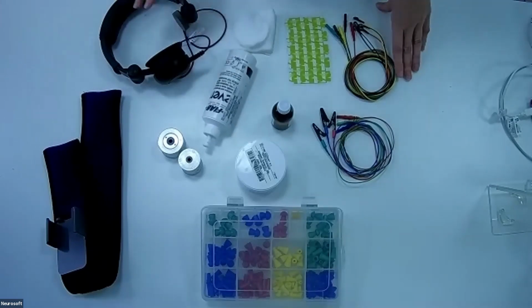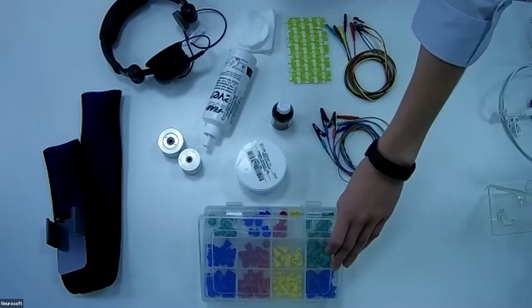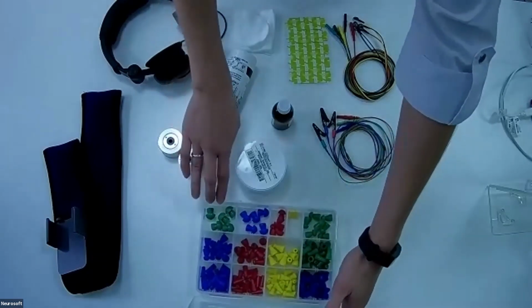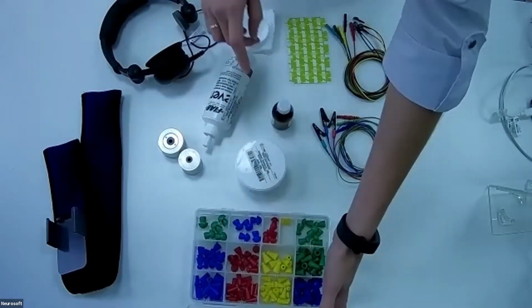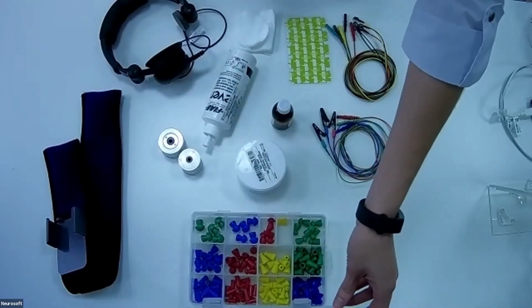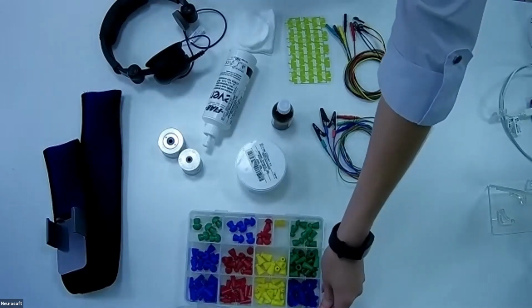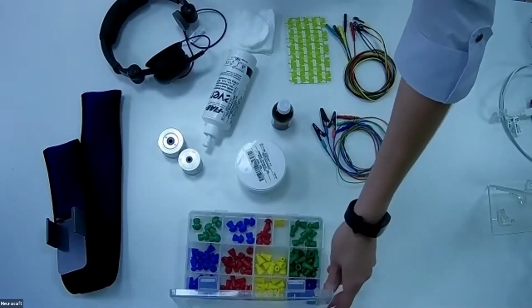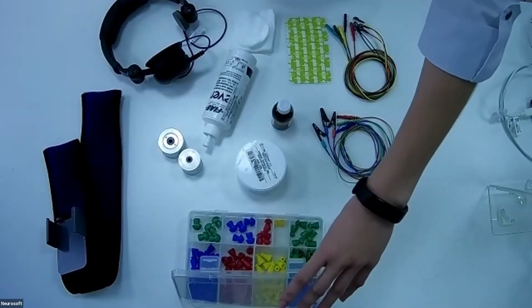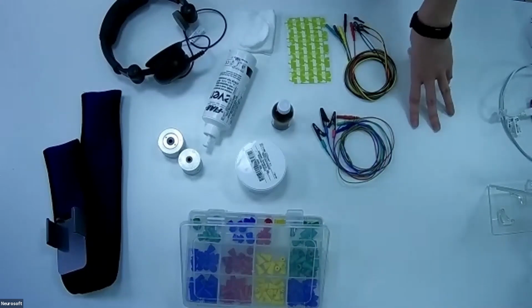We start with the acoustic immittance test, and the critically important thing in this test is to choose the proper size of probe tip, because the probe must be put tightly to the ear canal. It is critically important. So I pay your attention to this.